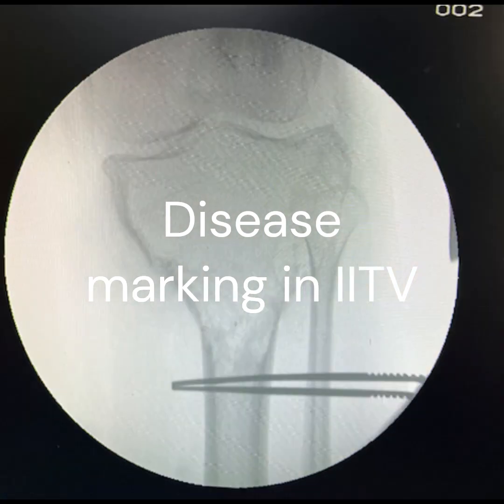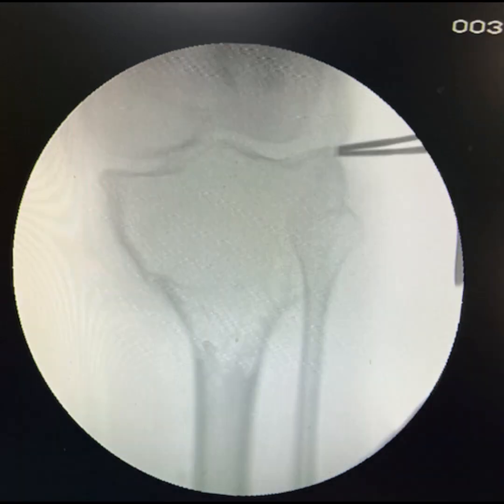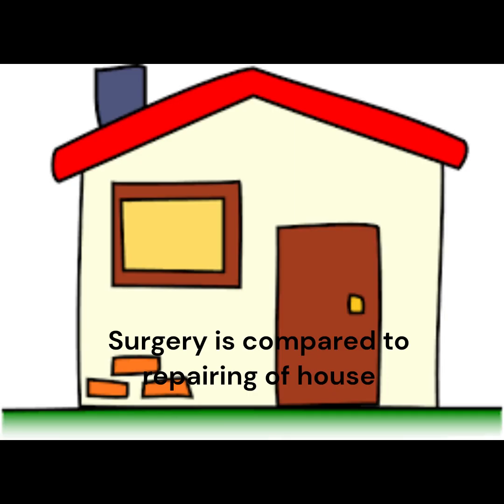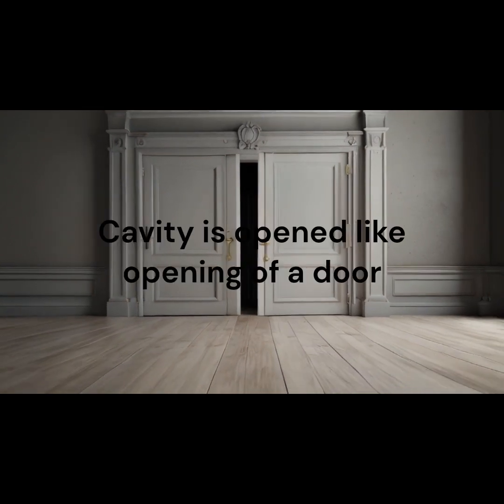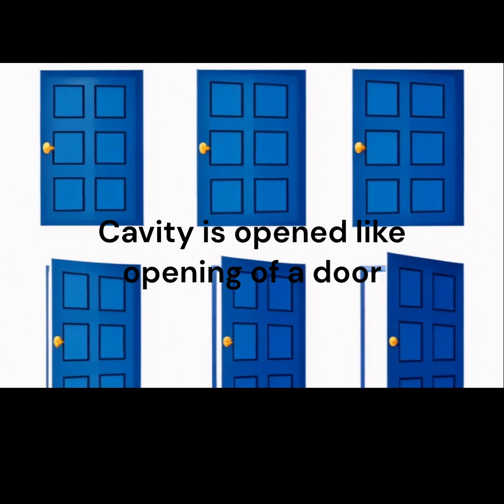Surgical treatment of Giant Cell Tumors of the Tibia involves curettage, extended curettage, bone cement filling, and plate fixation. The aim is to remove the tumor, prevent recurrence, and maintain limb functionality while preserving the patient's own joint. This can be compared to repairing a house — a window and door are opened, and the carpenter and his team perform all the repair work, preserving the entire home.